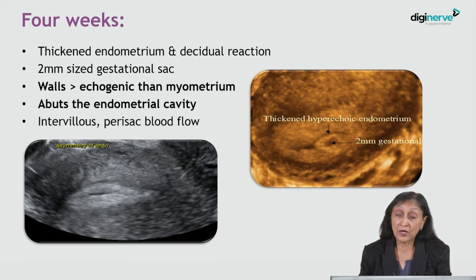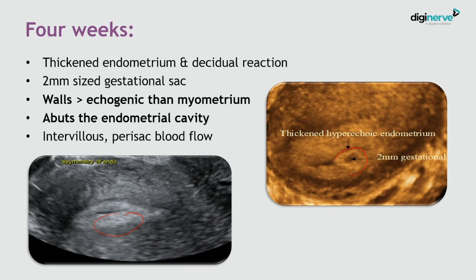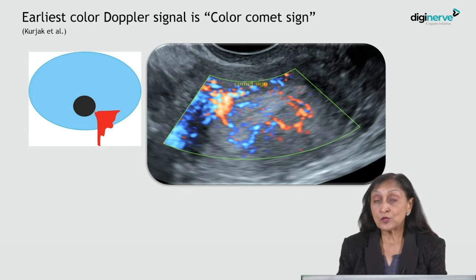At four weeks of pregnancy, the endometrium is thickened and there is decidual reaction which gives rise to hyperechogenicity of the endometrium. The gestational sac, if seen at that time, is just two millimeters. The walls of the gestational sac are hyperechoic relative to the myometrium and abut the endometrial cavity. On Doppler, a perisac blood flow can also be seen.